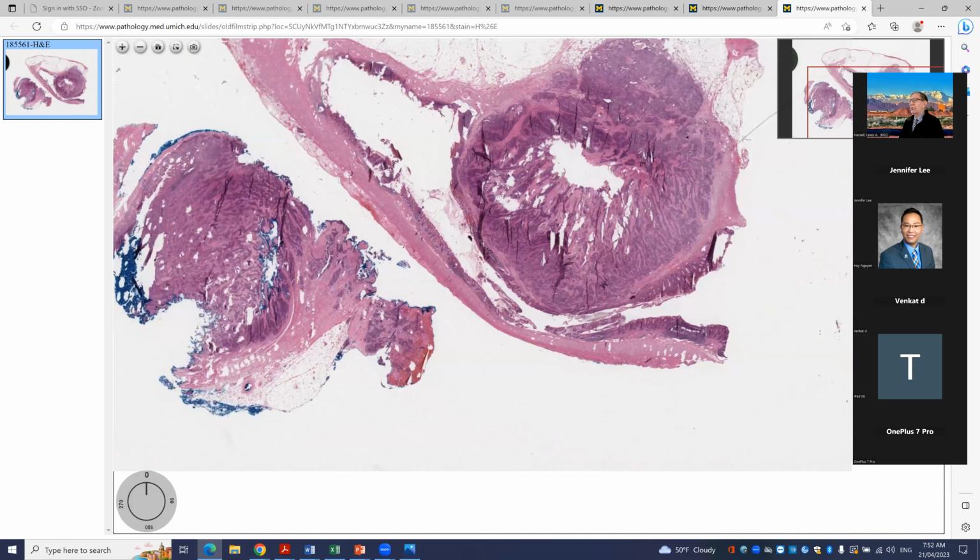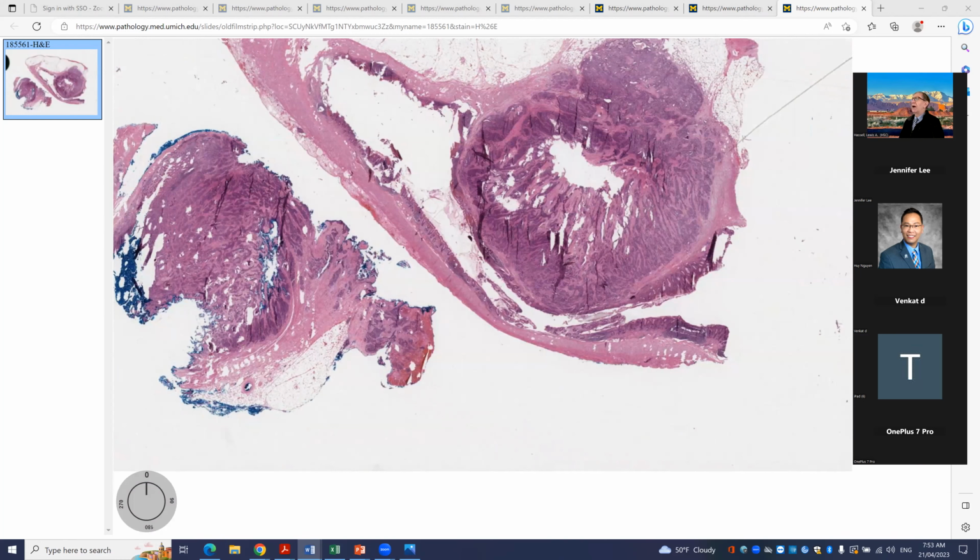Okay, so serous carcinoma is something we see almost daily, certainly every week in our practice, and so you get very used to it. But if you have a case like this, the kind of immunostains that we would use, typically we use WT1 to define the tissue as serous. Pax8 and WT1 are nice indicators of serous carcinoma.